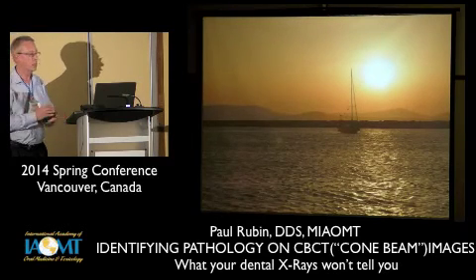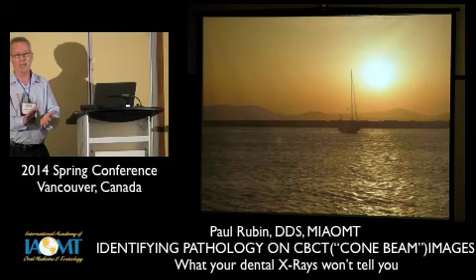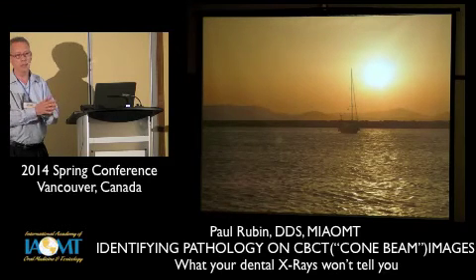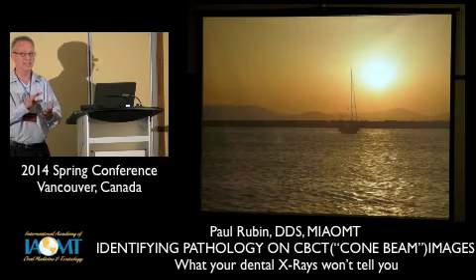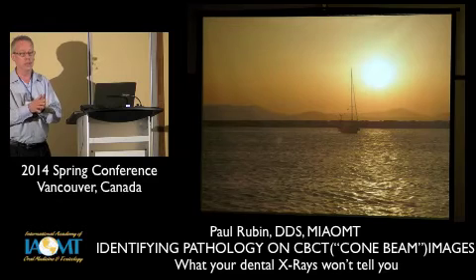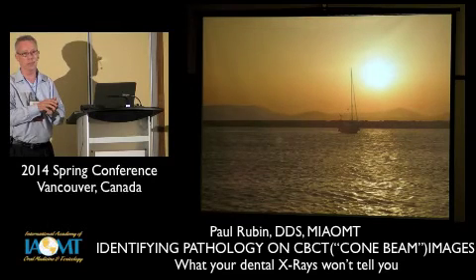You can see some real obvious things on a cone beam that you won't see on a panoramic or a flat image. And sometimes it's a little bit iffy looking at that. There are also ways on this unit, and maybe on other brands as well, where you can manipulate the bone and get a reading on bone density, and that helps to evaluate those areas. But from what I've seen so far, when it looks suspicious on the cone beam x-rays, it's definitely there, and it's definitely bigger than what you see on the image.